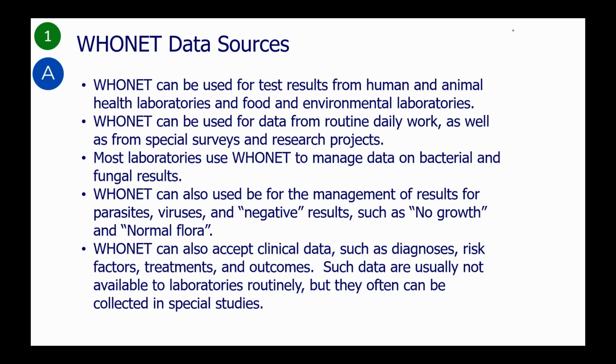It is also possible to enter clinical data into WHONET, such as diagnoses, risk factors, therapies, and outcomes. Such information is usually not available routinely to microbiology laboratories, but they can often be collected in a limited way for special studies.